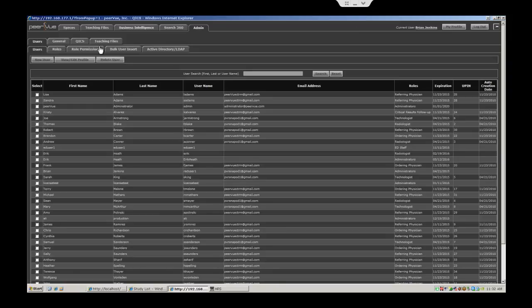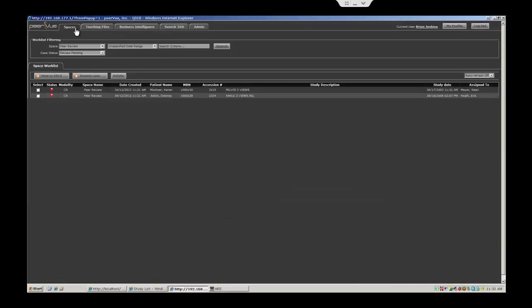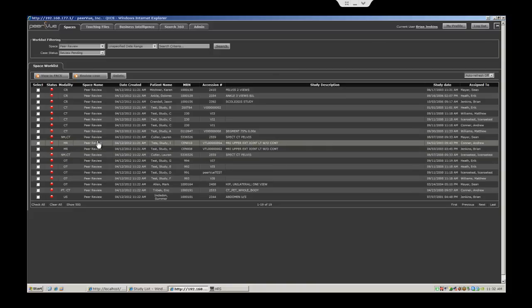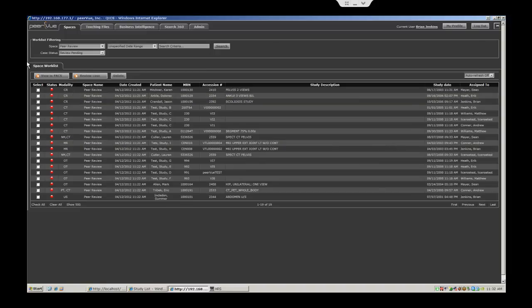peerVue has the capability to assign named users a list of cases based on any number of criteria, such as time of day, day of week, specific number of cases, or even subspecialty. The users would get a work list within the peerVue QICS application of peer review cases assigned to them.